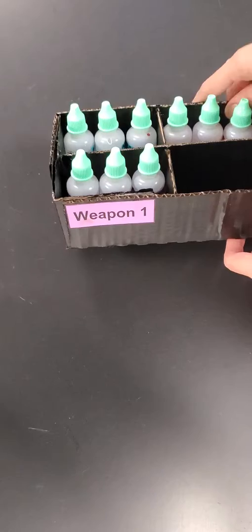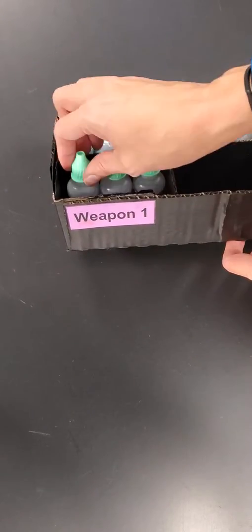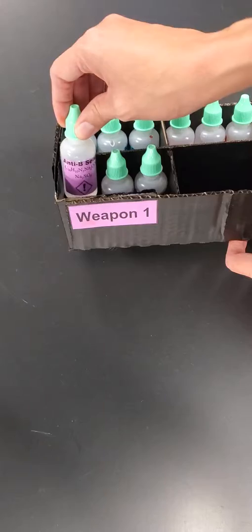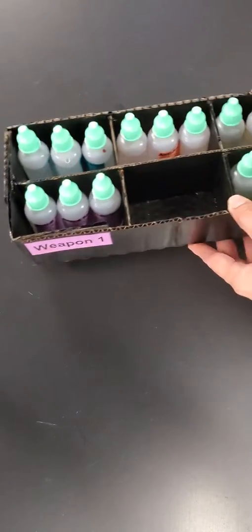Now, if you notice, for example, weapon 1 is color labeled purple, and so all the anti-serums that you're going to use for that weapon are also purple. So make sure that you don't mix different colors. So if it's purple, go with the purple color as well. So that's what you have in the box.